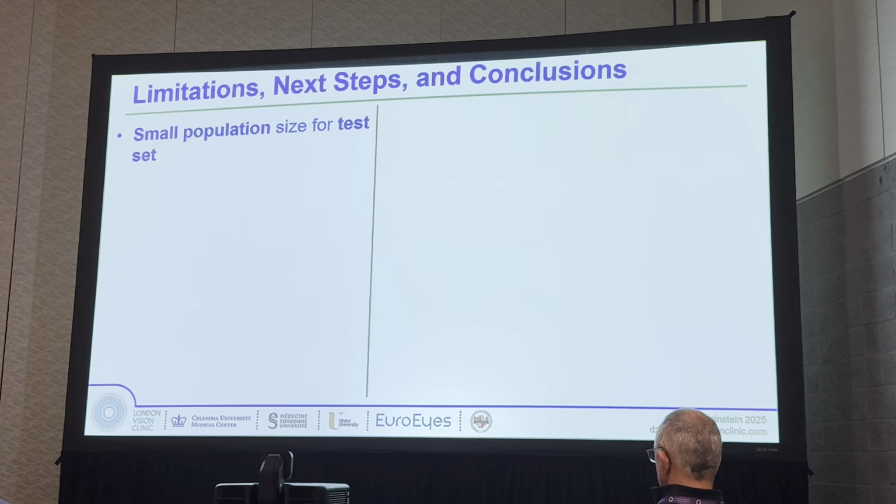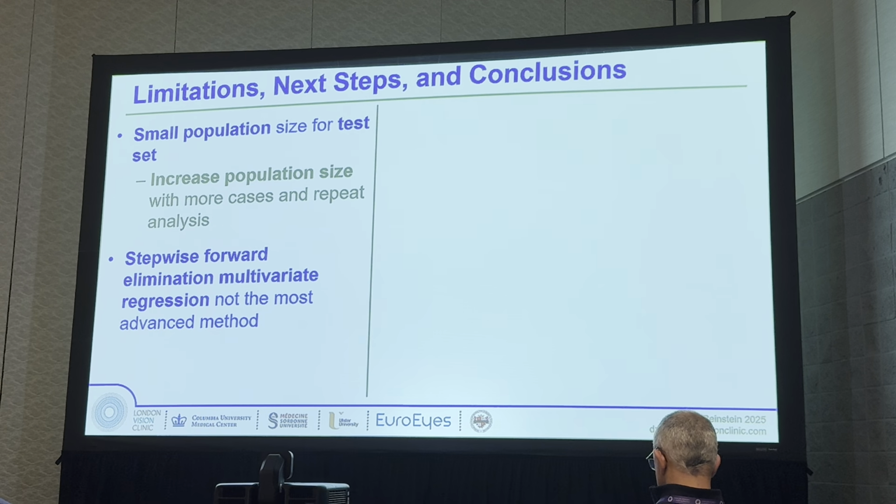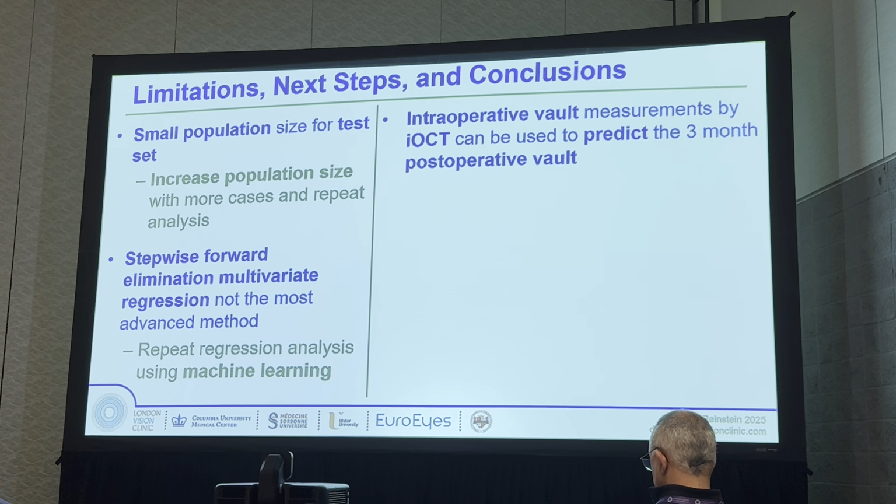Limitations of this study included a small population of only about 40 eyes. So a future study in our clinic is looking to increase this number. Of course, we've heard about machine learning in this series of talks, so it might be better to use machine learning in the follow-up study to improve the accuracy of prediction of our model. But in conclusion, intraoperative OCT is an excellent predictor of the 3-month postoperative vault.